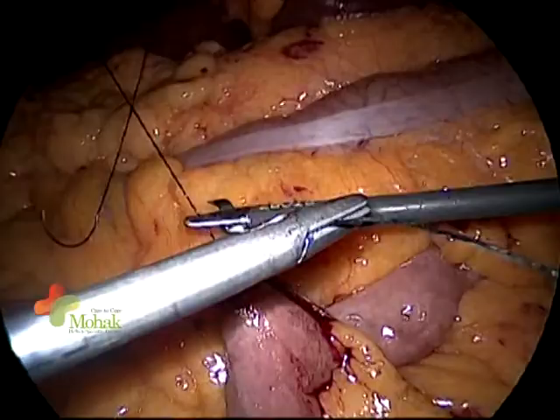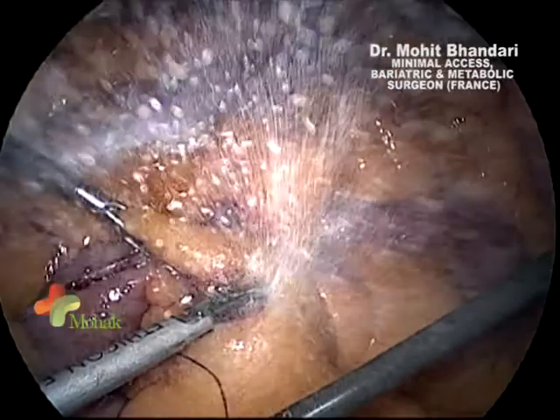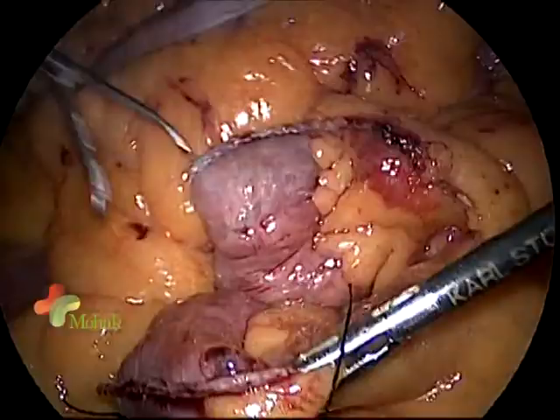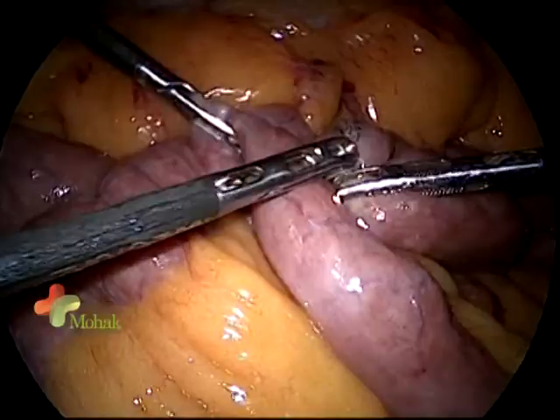I will mark my alimentary limb here so I do not get confused. I have taken a black silk to mark the alimentary limb, which is going to go up towards the pouch for the anastomosis. I will further divide the mesentery to achieve a very tension-free anastomosis. A key tip: because you are close to the staple line, first use a harmonic to divide, then come with a ligature, as clips or cartridges are perceived as foreign bodies there.